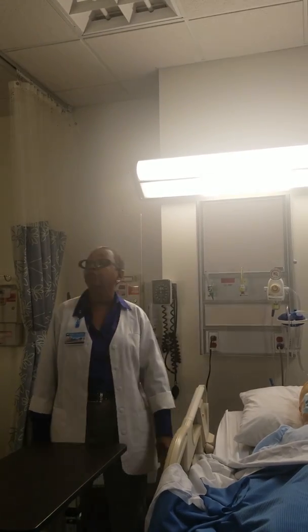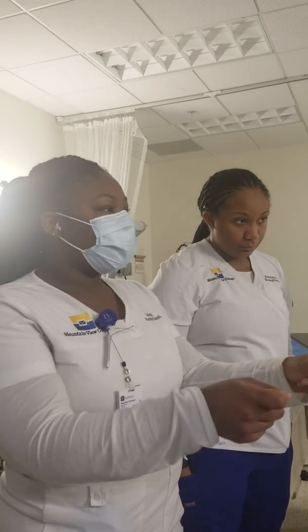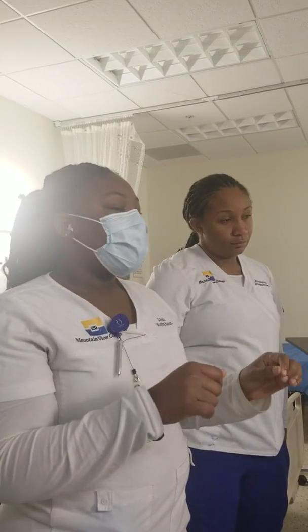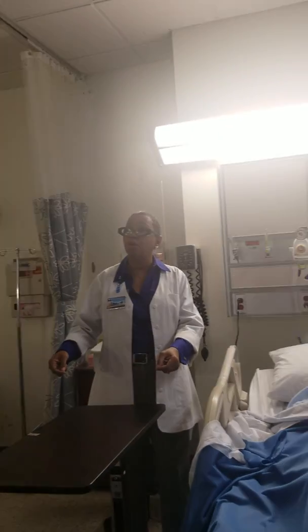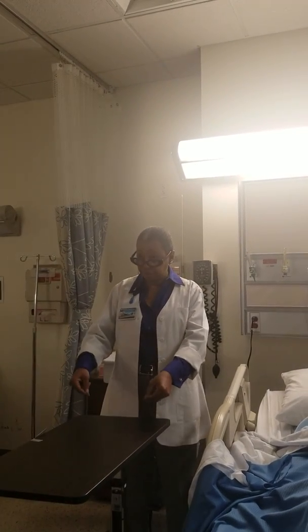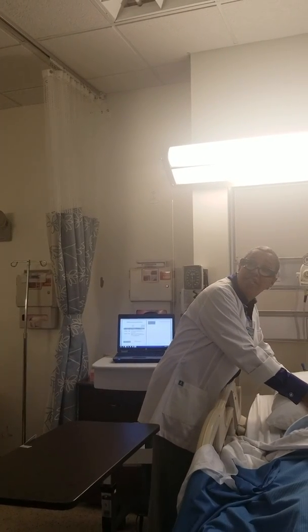I have another question. Sure. With one hand being dirty, when we apply the dressing on top of the insertion site, how do we do that? Because we're going to need both of our hands. Yeah, so you pull it off. When you pull it off, you've got a 1-inch border. Still got 1 inch here, so you go here. I just picked it up here and moved it here and put it down like that. I haven't touched anything.